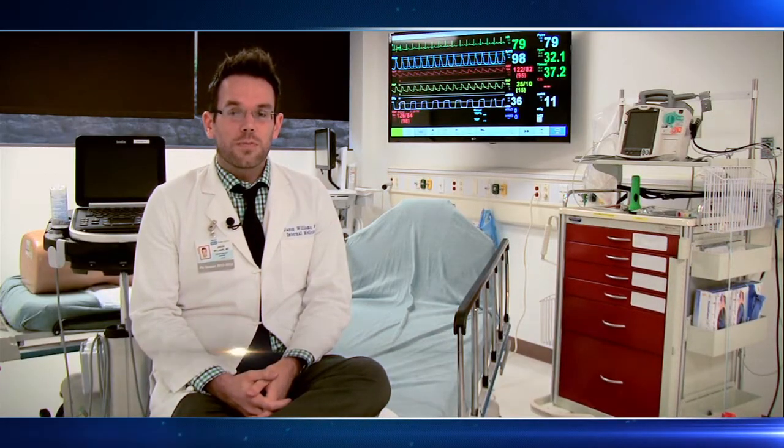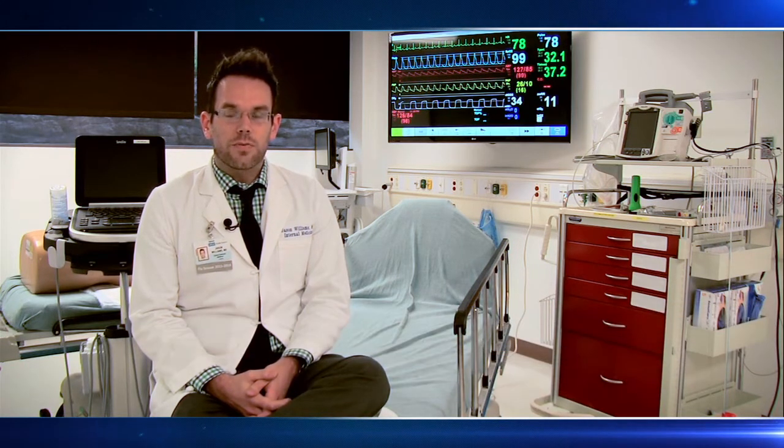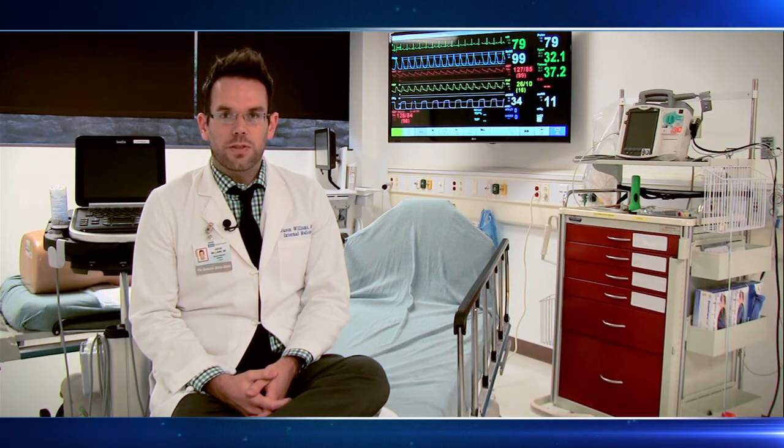Hello, I'm Jason Williams, a clinical instructor of hospital medicine and proceduralist at UCLA. Today we'll be covering arterial line catheterization of the radial and femoral arteries. We'll go over the indications and contraindications for the procedure, the equipment needed, step-by-step performance of the procedure, as well as the potential complications to look out for.